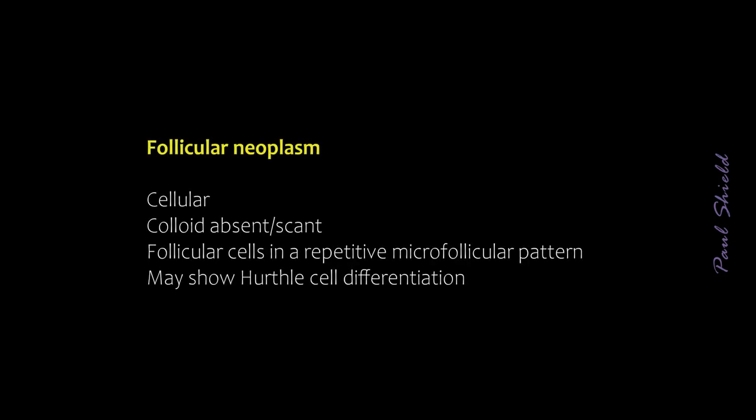So just to summarize, follicular neoplasms include follicular adenoma and follicular carcinoma, so non-invasive and invasive lesions respectively. We can't tell those two apart based on cytology. It requires excision of the lesion and a very detailed histologic examination to look for vascular and capsular invasion by the lesion. This doesn't matter because the treatment is the same for both.